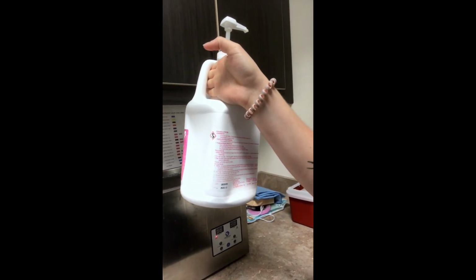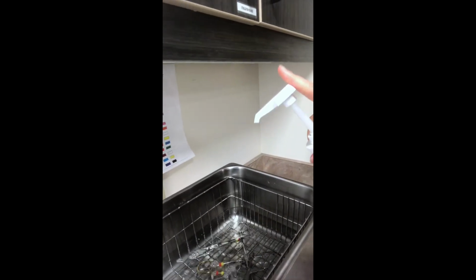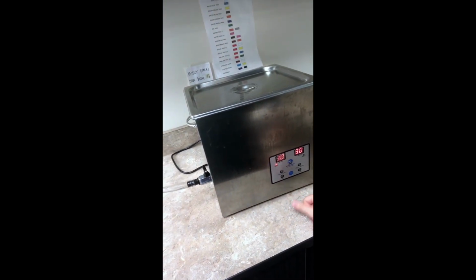On the back you have the directions. It says use 1 pump per gallon of water. So we have a gallon of water in here. We're going to use 1 pump. Now we are going to put the lid on. This runs for 10 minutes.